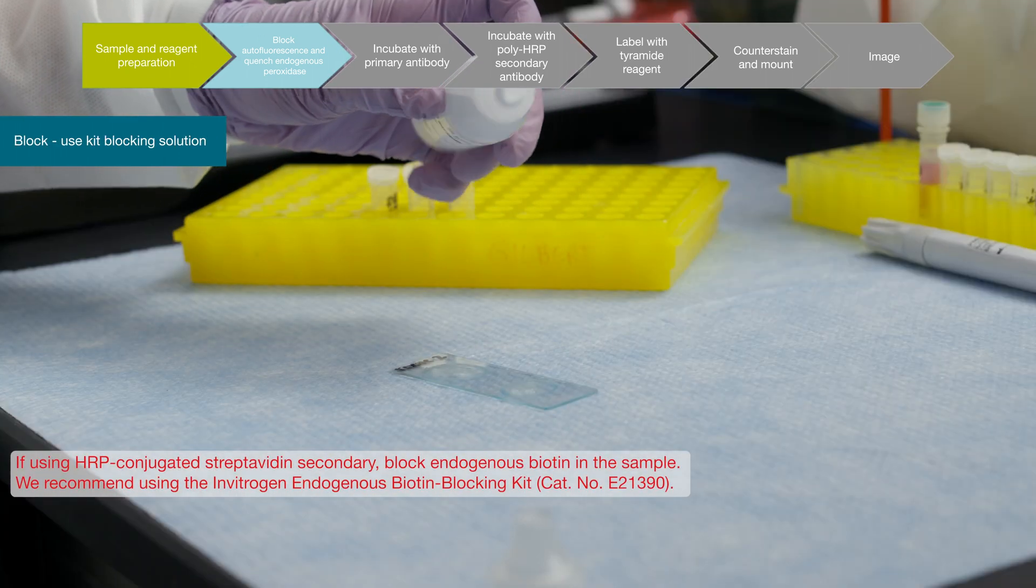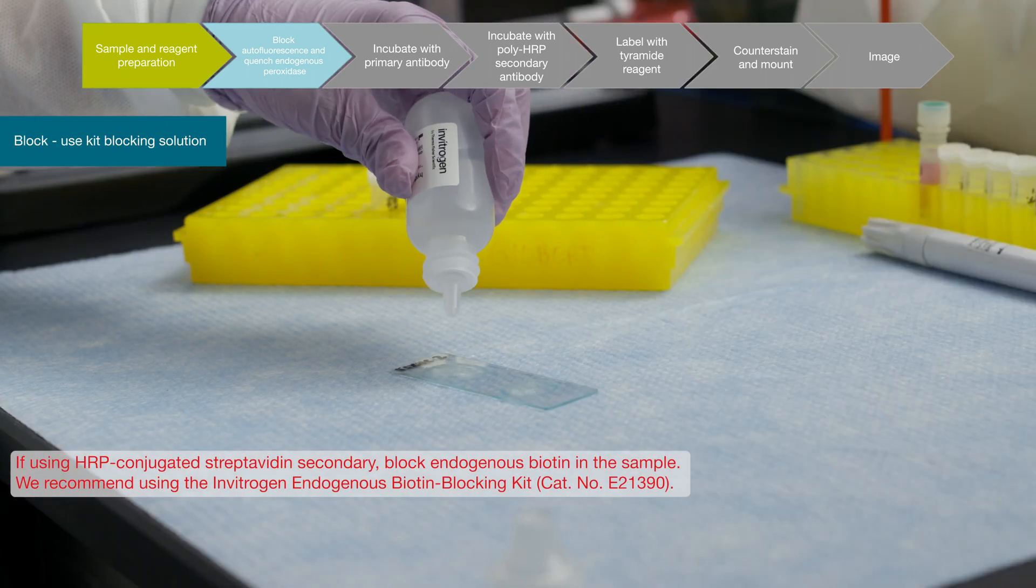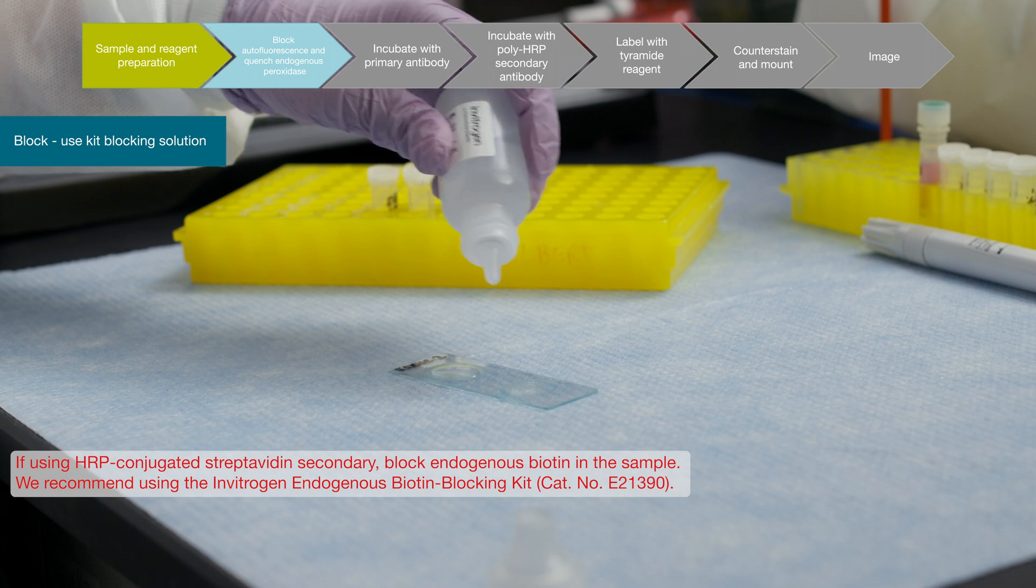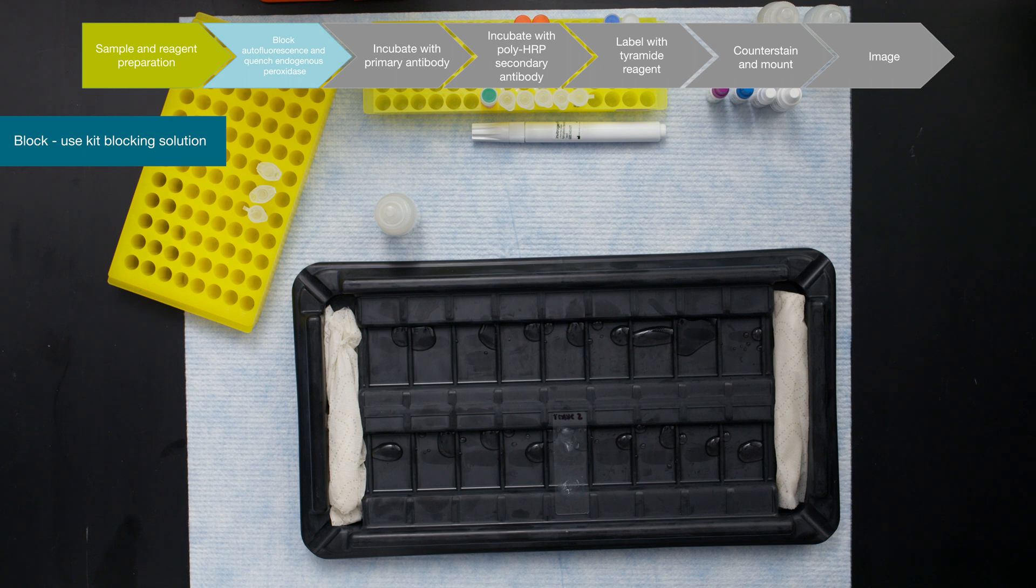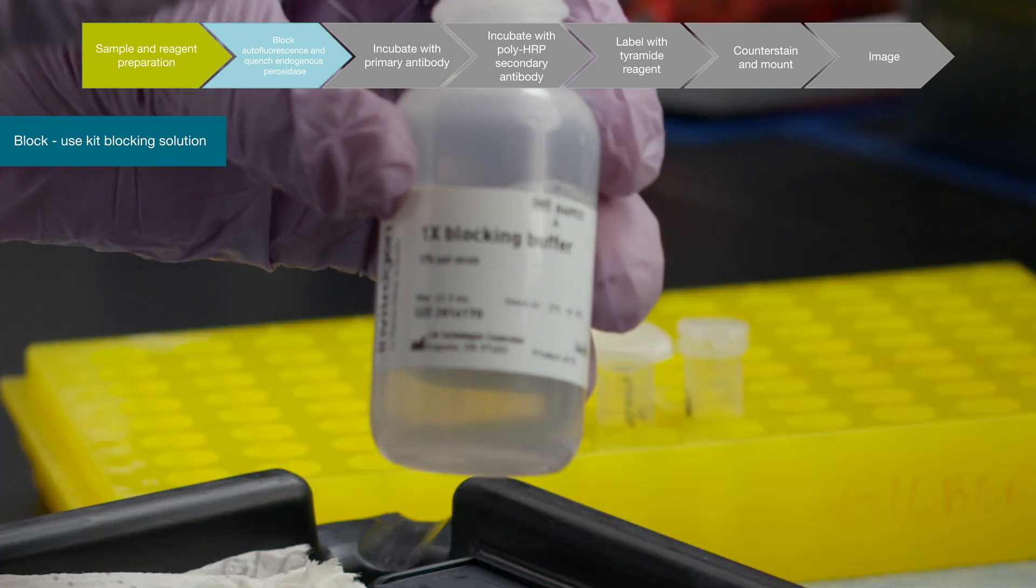Since Tyramide amplification requires using an HRP enzyme, it is mandatory to quench the endogenous peroxidase activity of the sample. Afterwards, block the samples for non-specific binding using the provided blocking buffer.